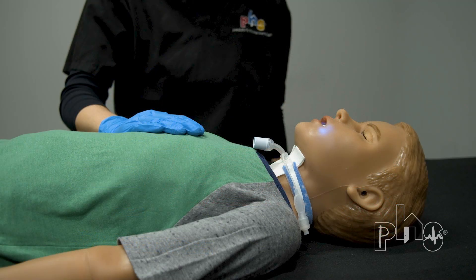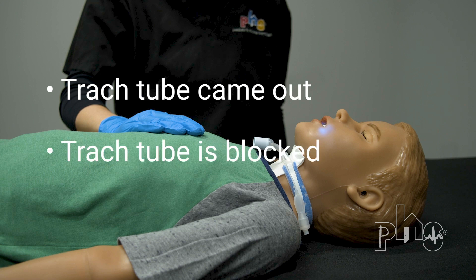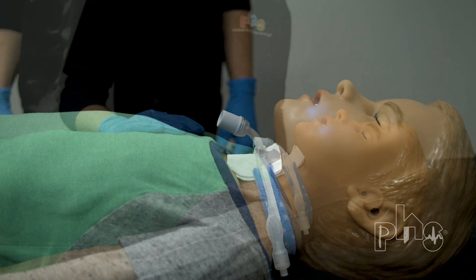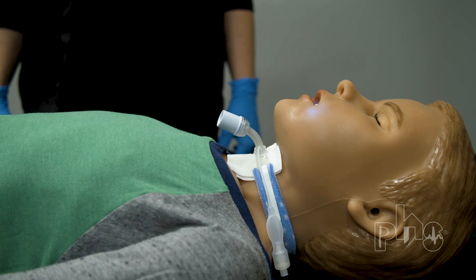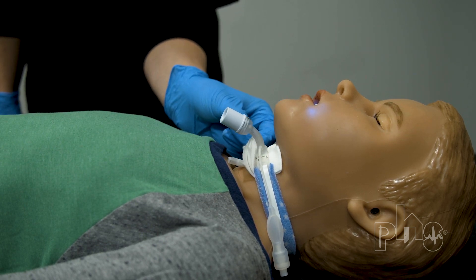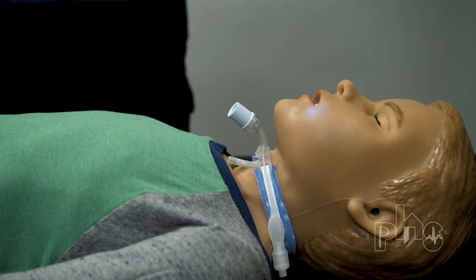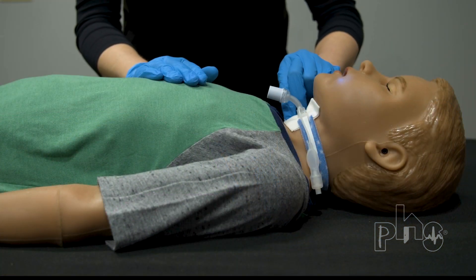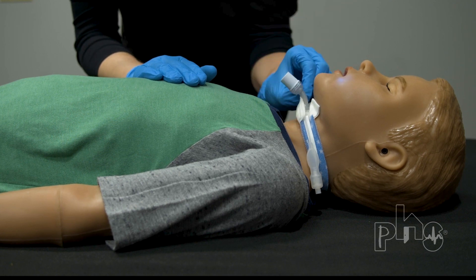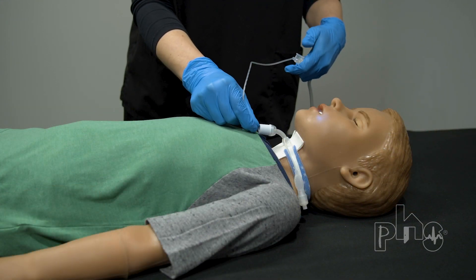If the patient has difficulty breathing, the most common cause is the trach tube came out or it is blocked. First, always check that the trach tube is in the trach stoma. If the trach tube has come out, get a trach tube in as quickly as possible. We will demonstrate how to place a trach tube later in this video. If the trach tube is in place, it may be blocked. Suction the trach tube to the identified safe suction depth.